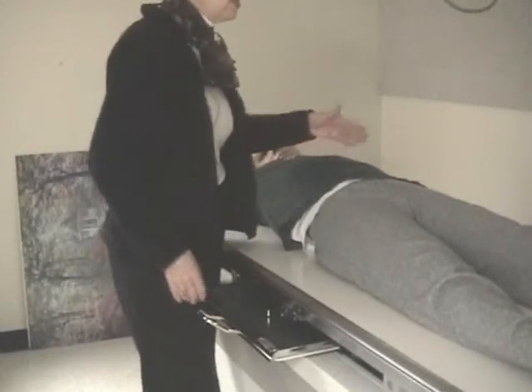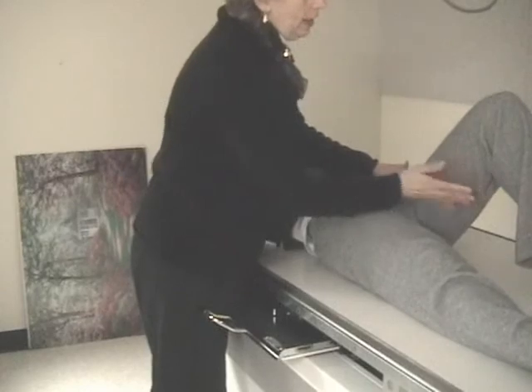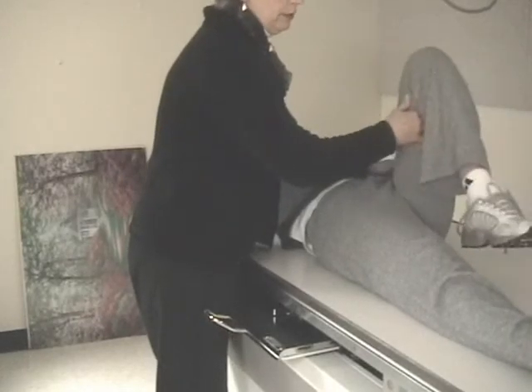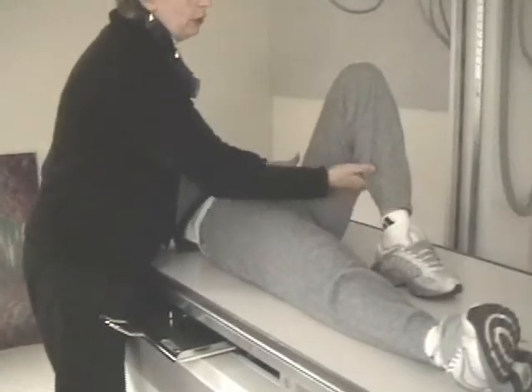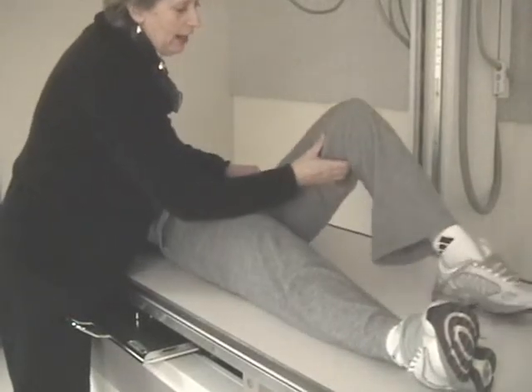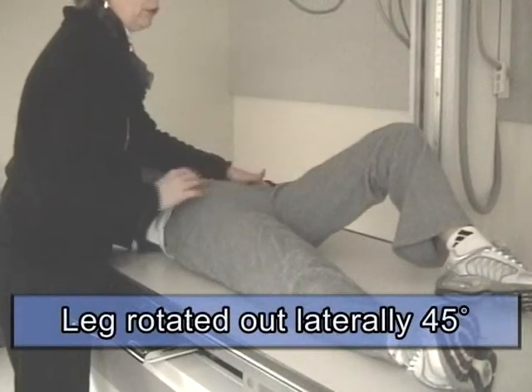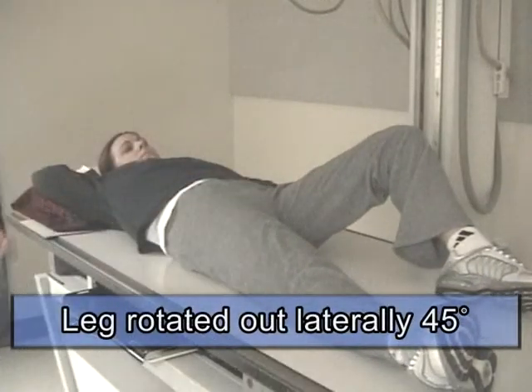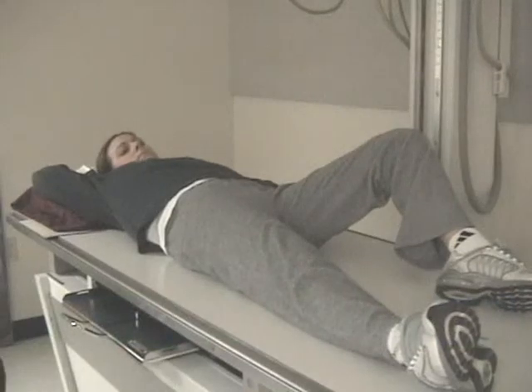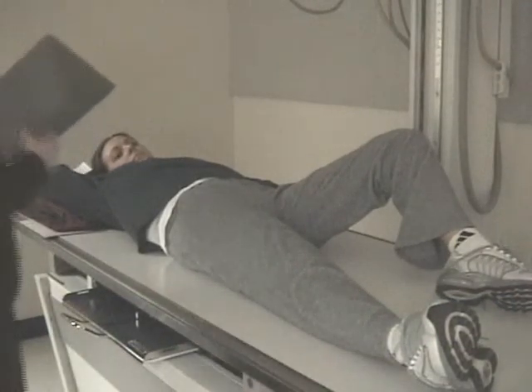The affected side that you're after, you bend that knee, and you don't want it bent too far. That would be too far. Or you don't want it barely bent. It's kind of just an average. And then the leg is rotated out laterally to 45 degrees. If they have difficulty holding it, go ahead and give them a 45-degree sponge to rest on.